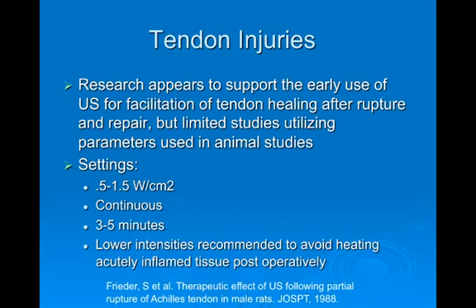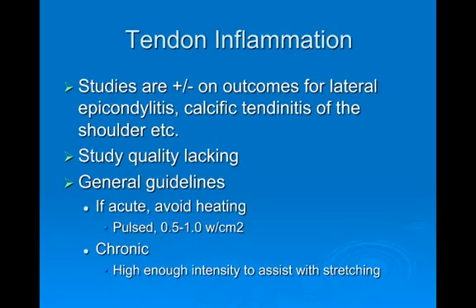So one thing to note here is that they're recommending continuous, but notice the duration is very, very short, and also you want to avoid heating something so you're not increasing the inflammatory reaction. Okay, so looking at tendon inflammation, then very plus minus on things for things such as epicondylitis, calcific tendonitis, things like that.